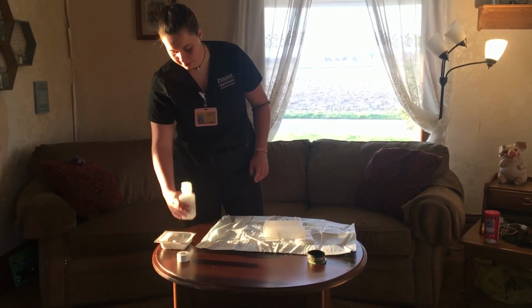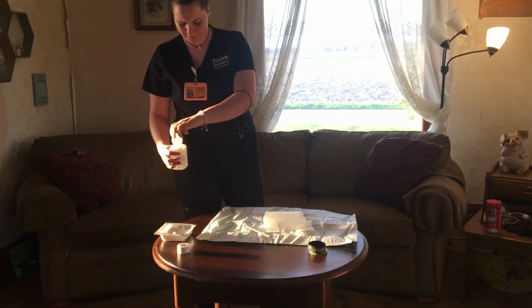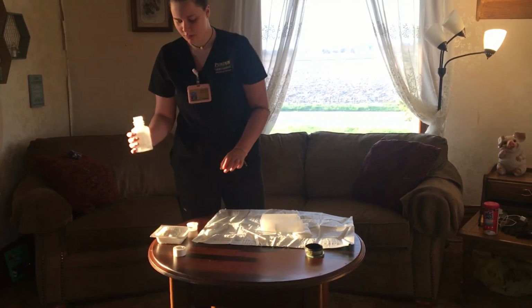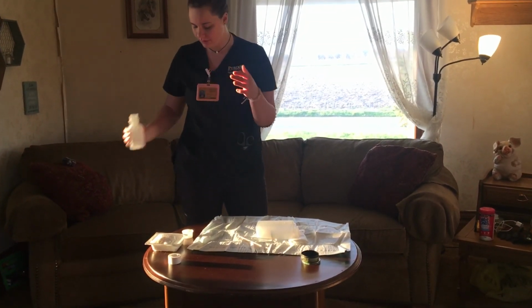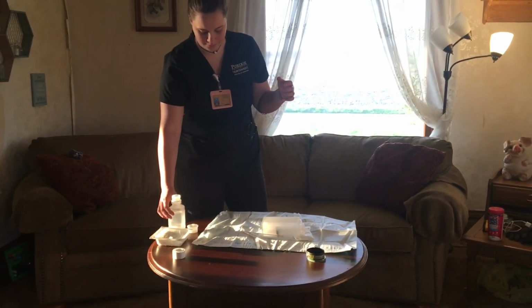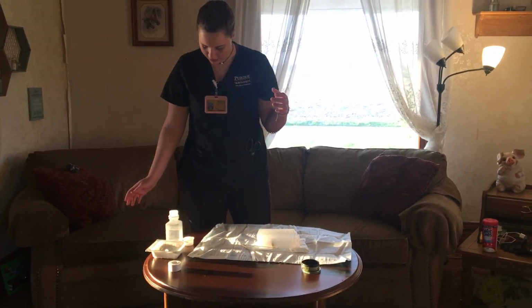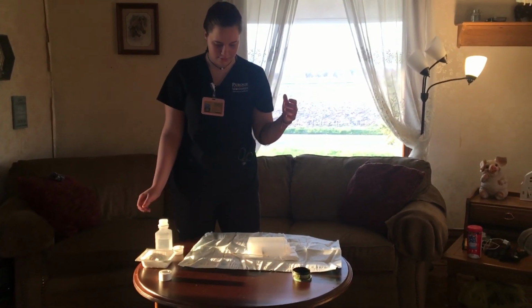Open this up since we're non-sterile right now. Put the cap facing up. You want to flip it into the trash and make sure that you cover the label. So I flip it and then I pour some into this gauze. And then I set it down here. And then I would get sterile gloves.